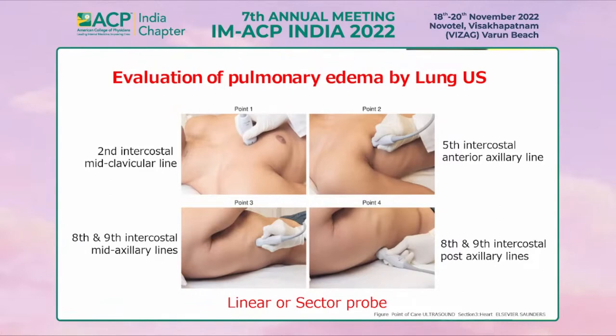The important thing is to evaluate the entire lung by sliding headward or caudally, not just at the location. The probe can be linear or sectoral.